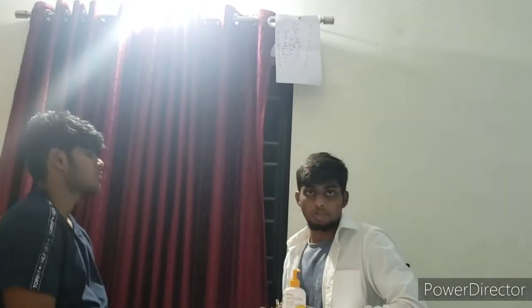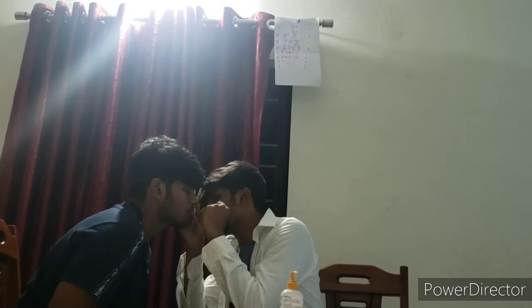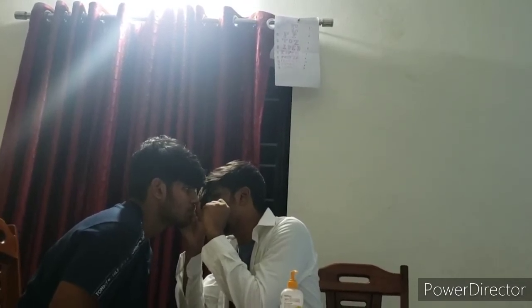Now I'm going to examine the patient's right eye, so I'll be using my right eye. I can see the light reflex, and there is no opacity. I'm moving further in.